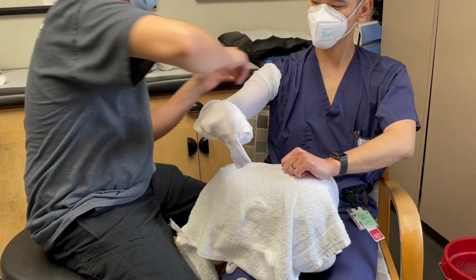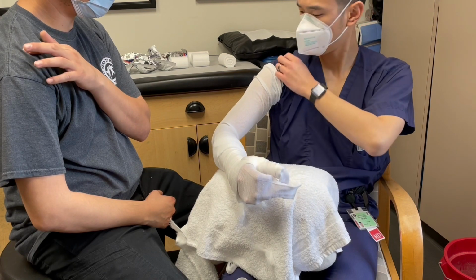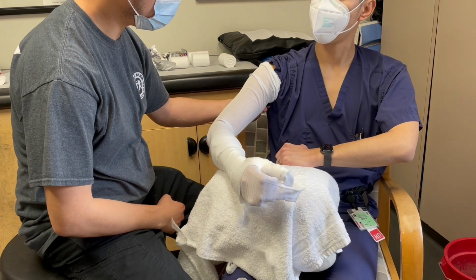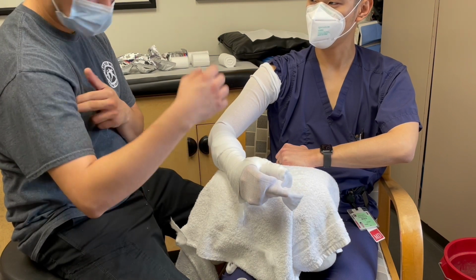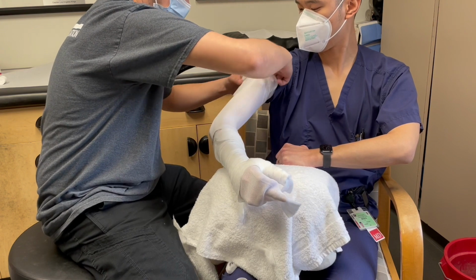We now move on to the long arm cast. We place the stockinette up to the AC joint and 2 finger breadths distal to the axilla. Note, for a long arm cast, we used a 3-inch stockinette. For the short arm cast portion, we used a 2-inch stockinette.